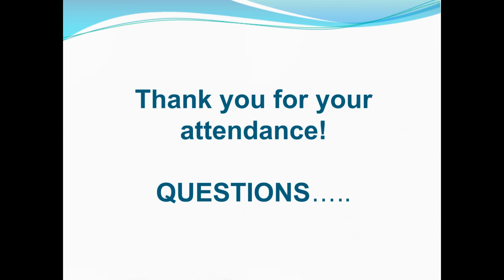Perfect. Next question. Have you had any supply issues? No, just like I said, if we forget to order, that's really the only supply issue that we've ever had. All right, next question. Did you identify any yeast from the blood cultures? That was the only issue that we had, so we do not use it for yeast. If we do get a yeast, we will go straight to our molecular instrument.